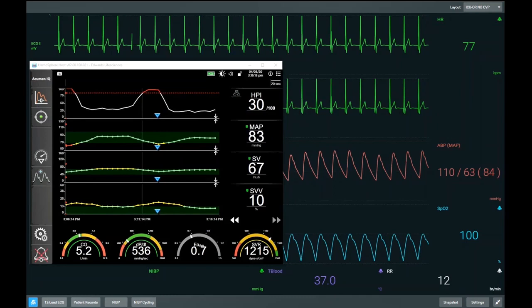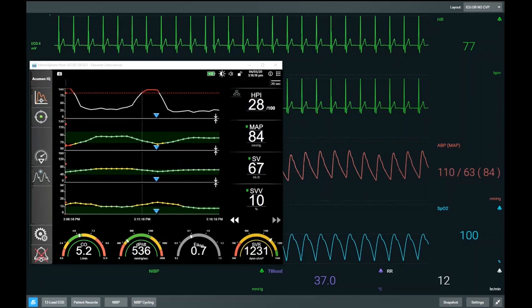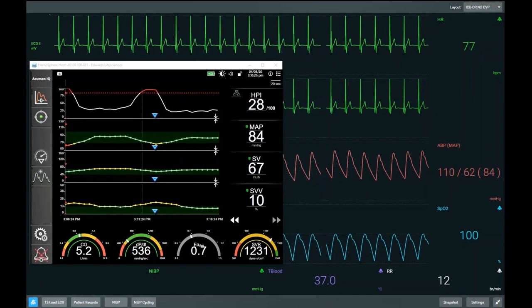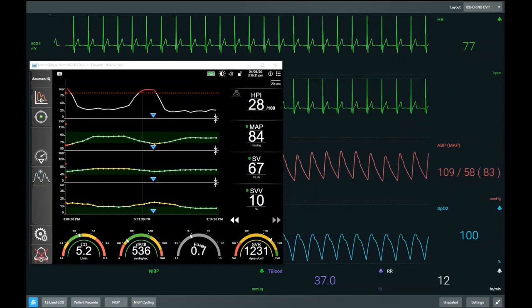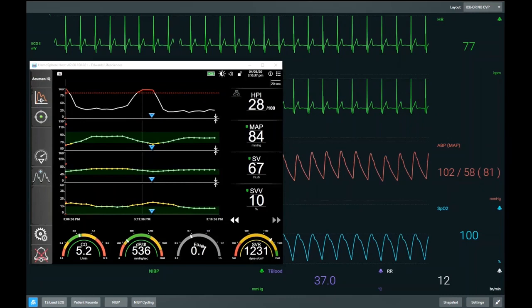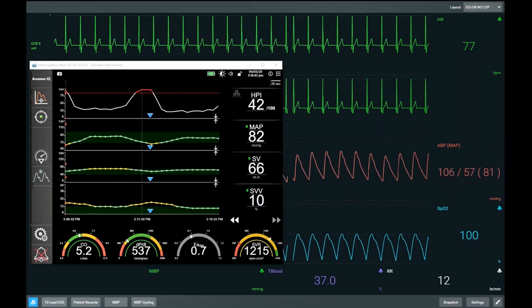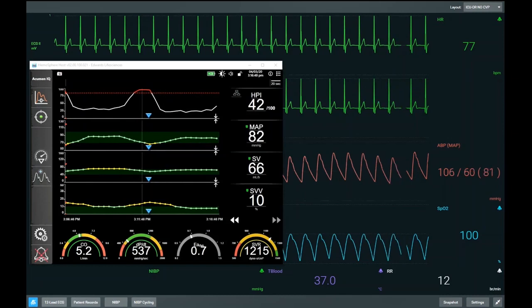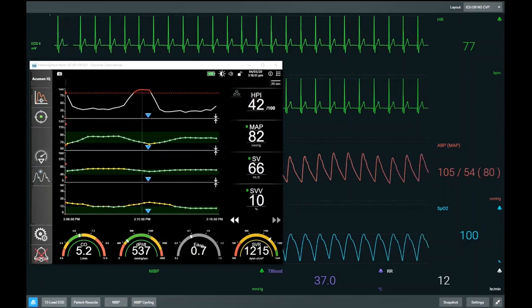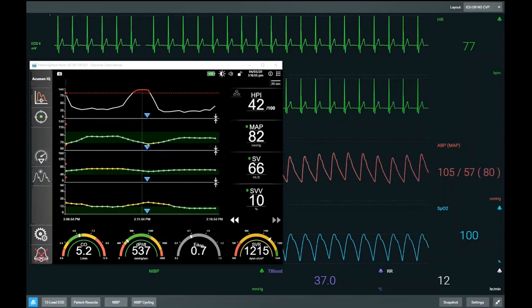Looking at HPI, we see it starting to increase from our baseline of 28. We've been stable for the last couple of minutes and it will slowly start to increase. Our underlying physiology is looking relatively normal — MAP is in the 80s, a good stroke volume at 66, back to our baseline values, and the patient is not a preload responder in this case.